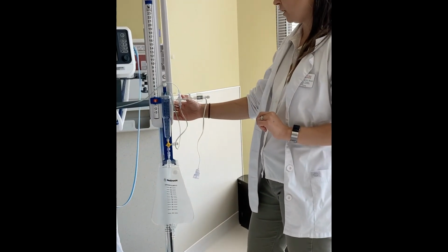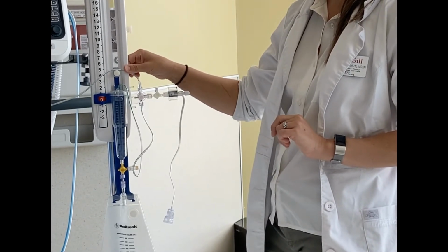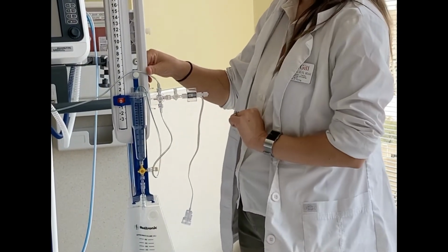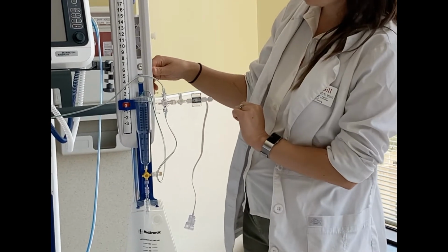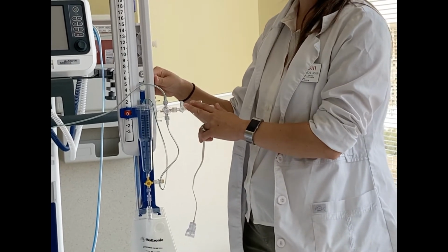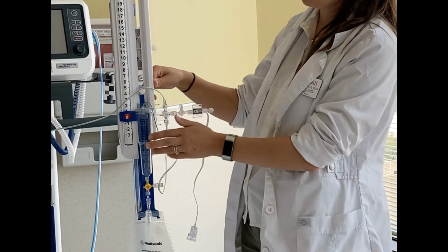One important thing to remember is that if your patient is on continuous CSF drainage, they should not be left unattended, and you should be checking the amount of CSF drained in this chamber every 1 to 2 hours. Now, another thing to note is that if your system is open to CSF drainage as well as to measure intracranial pressure, the intracranial pressure is going to be affected by the pressure of the fluid draining into this chamber.